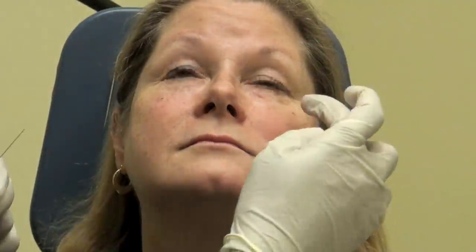Finishing touches over here, then I'm going to come back and track that hollow from the other side. Does it look like it blends a little faster? Yeah, it does. It really does. It looks good. Now I'm going to come on the other side — Sam's going to swap me here — and we're going to go after that part of the under eye hollow.